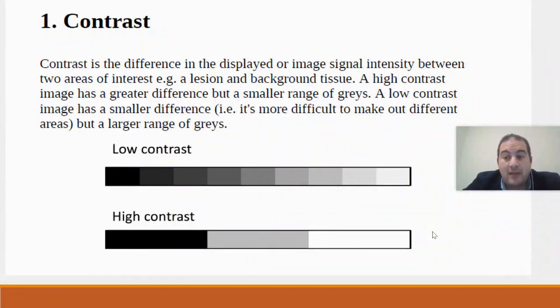There are also factors that affect image quality, as I mentioned, such as the image that was produced. Were you able to perform post-processing on it? You can control and manipulate the window level and window width of the image, and you can improve its contrast.